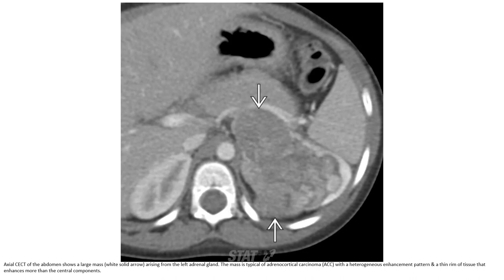This is a contrast CT of the abdomen showing a large mass arising from the left adrenal gland. The mass is typical of adrenocortical carcinoma (ACC) with a heterogeneous enhancement pattern and a thin rim of tissue that enhances more than the central component.